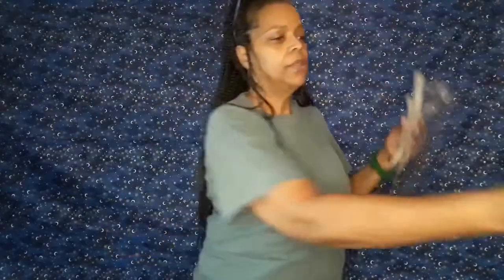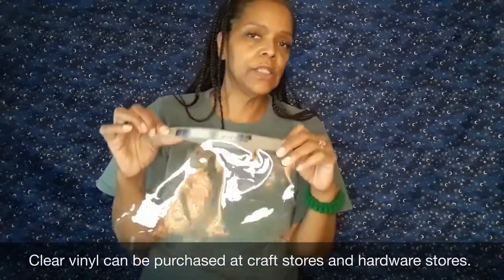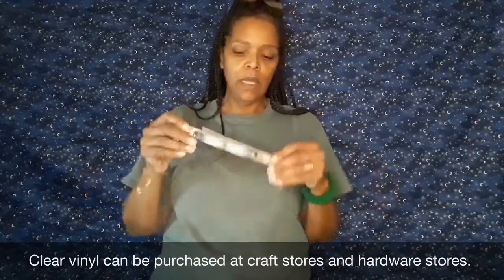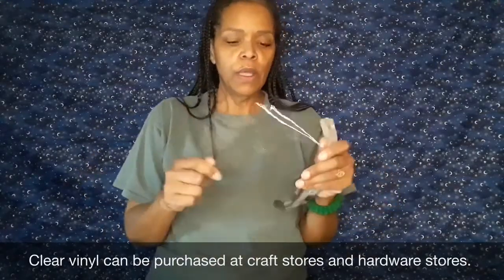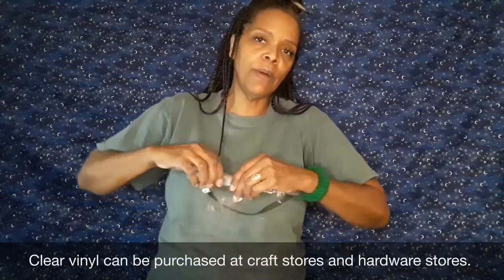This one I made out of a paper protector acetate sheet protector. This one I made using vinyl, and I've used different gauges of vinyl from roughly 10 gauge to 18. The thicker is harder to work with. This is, I believe, a 10 or 12 gauge that I got from my friend Bobby Moon. So I wanted to show you all quickly, it's a very easy process to make a shield.